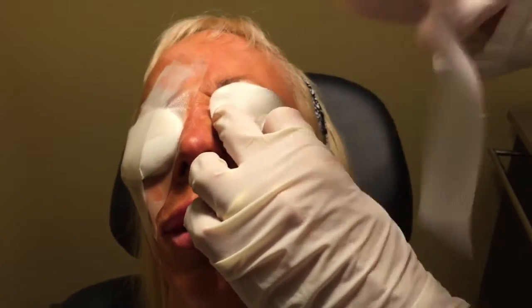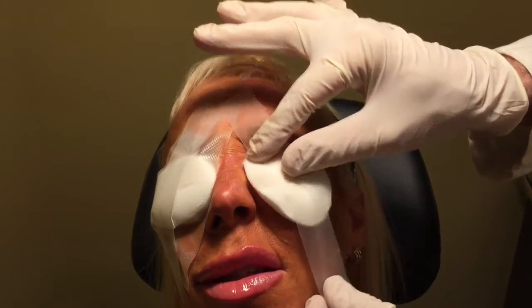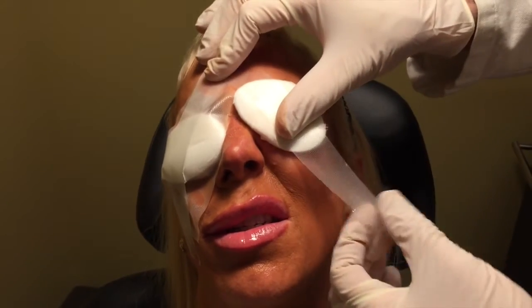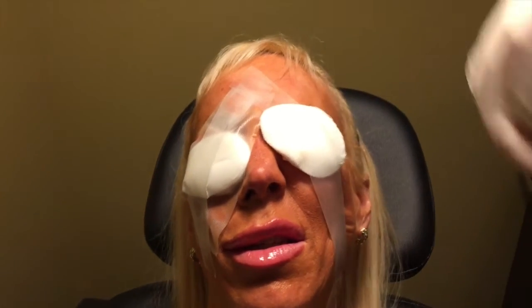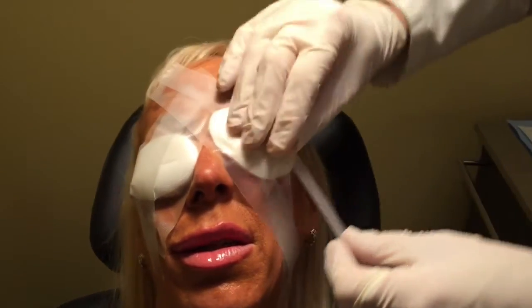Usually I start up in the forehead, and I pick up. Nope. One more time here. We start up in the forehead, and then put the second part on the cheek region here. And the last one, I create a little more pressure on this last one here. I'm going to drive that into the tissue.